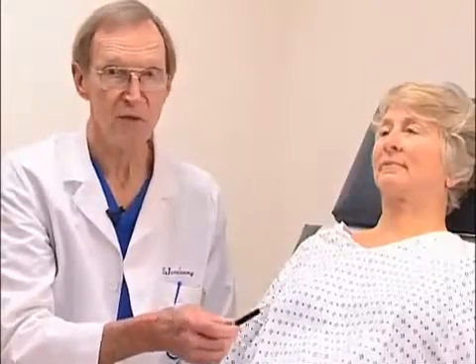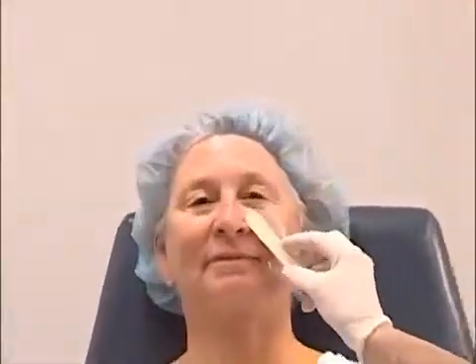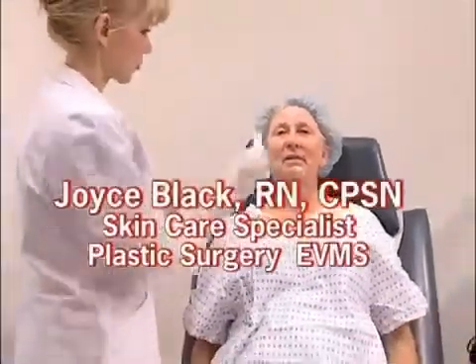We're going to put some topical anesthetic cream, and we're going to give her an injection of Versed intramuscularly into the lateral thigh, about 3 milligrams. And this will help her relax for the procedure along with the topical anesthetic. We give xylocaine 5% topical ointment or BLT cream, but leave it on for about 30 to 40 minutes.